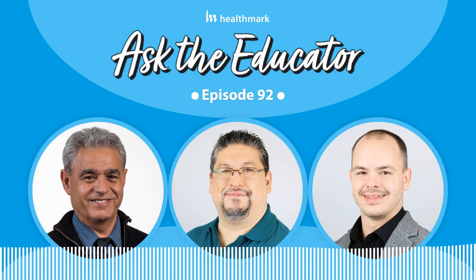Say, for example, we have 100 conductors in a cord, and over time, say 80 of them break. Those 20 will probably still work and give you energy. But if you don't have adequate energy, the surgeon, for example, says to increase the energy by X amount.